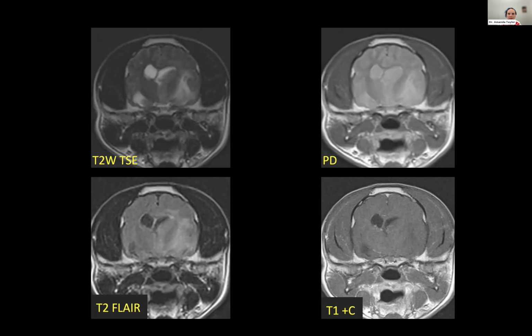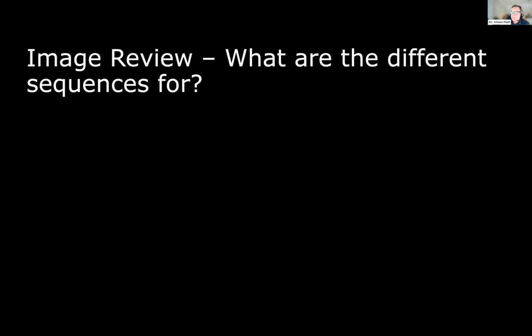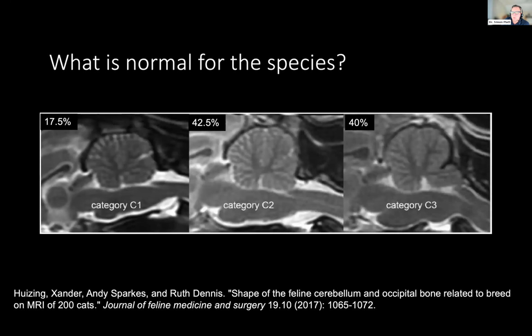Regarding the cats that you showed from that paper, with a variety of vermis positions, is there a way to check whether this is a normal variant, or something that's more concerning for a pathological herniation?